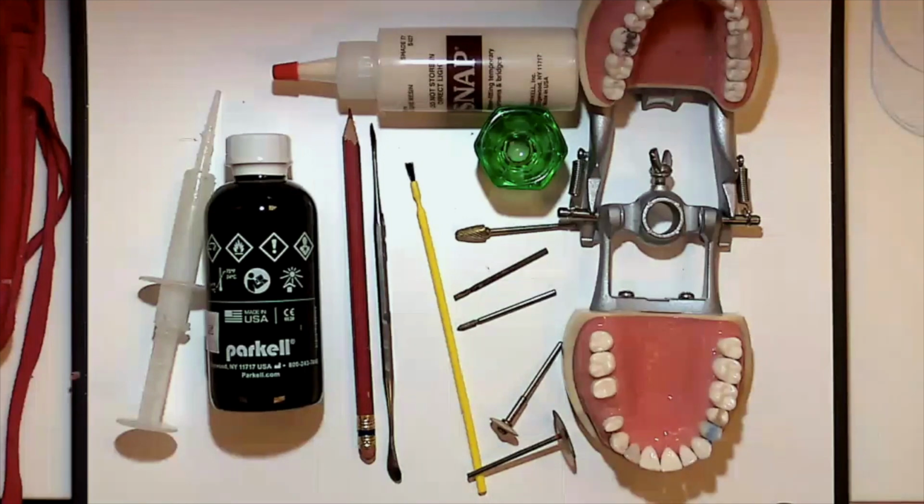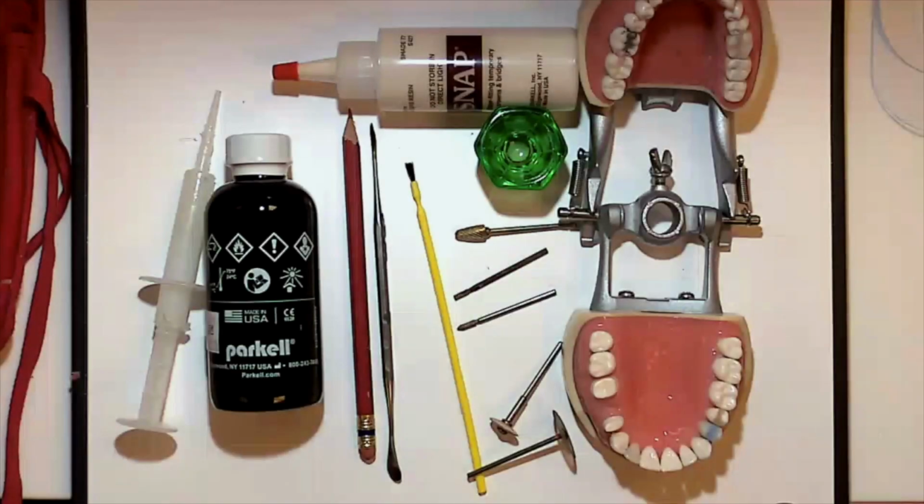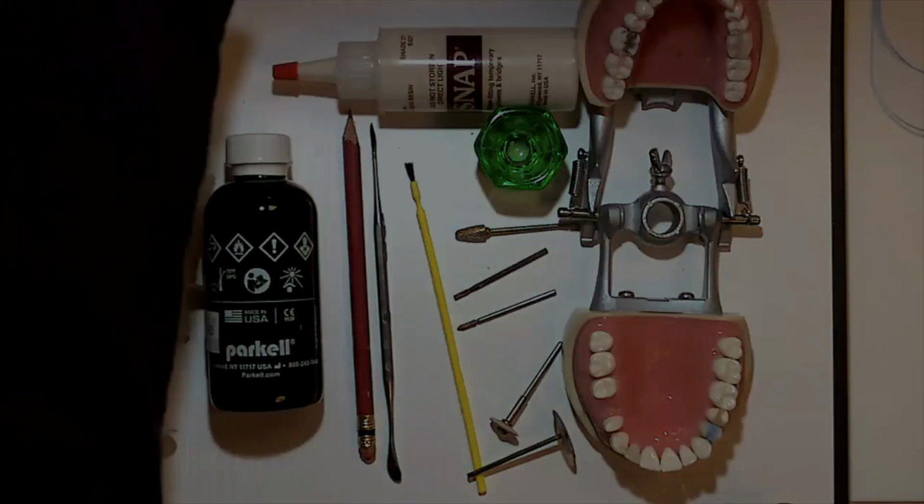which is a diamond multi-sided wheel. I like to use an ethyl methacrylate such as Snap for this type of bridge because it has a lower exotherm temperature during curing. Also, there seems to be less polymerization shrinkage compared with Jet.